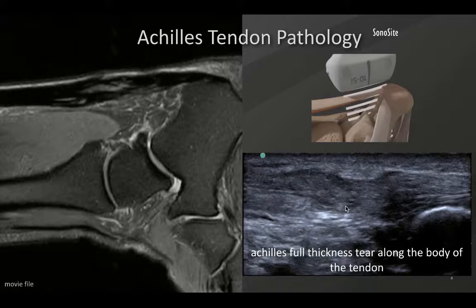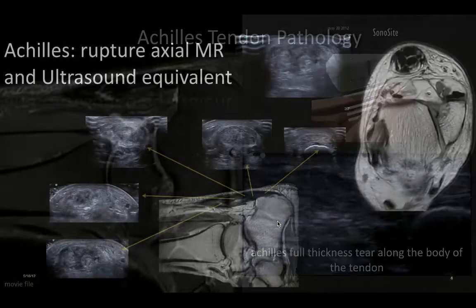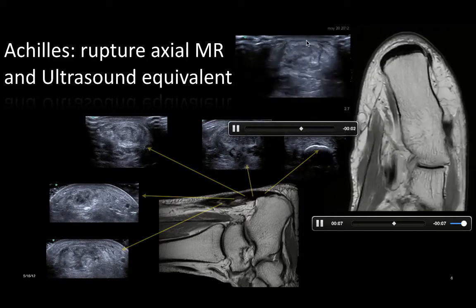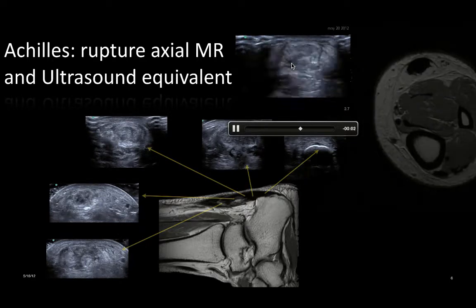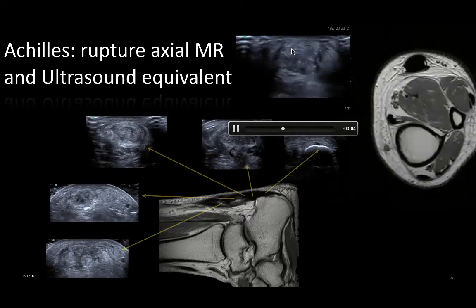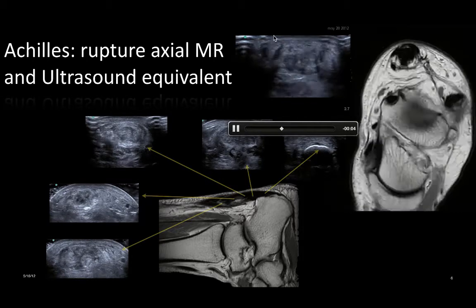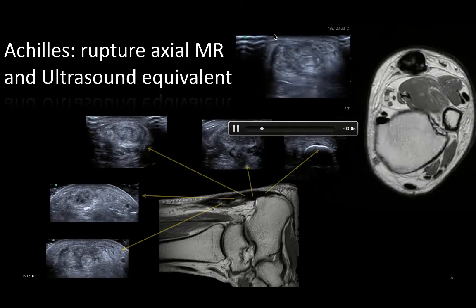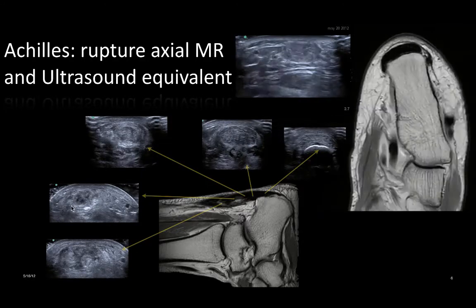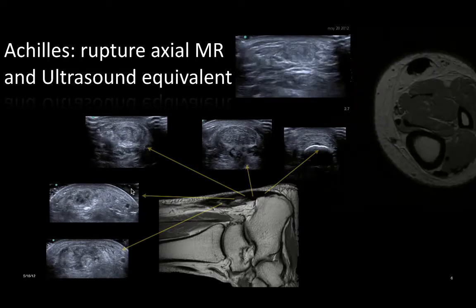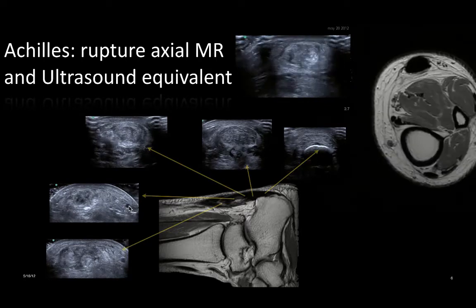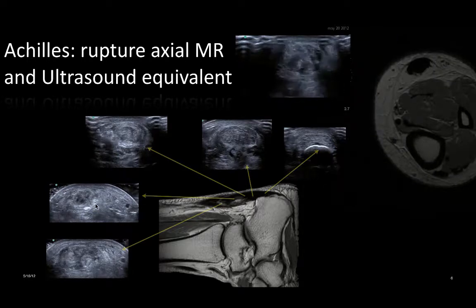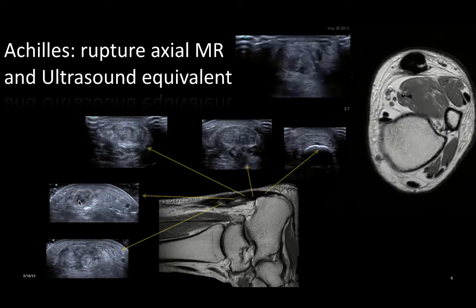The overall architecture is severely displaced. As we look at this tear further on transverse scanning, we're going to take a sweep through the Achilles tendon to its enthesis. One word of caution here is to use lots of gel — you do not want to use a sparing amount, because the pressure of just trying to maintain transducer contact will collapse useful pathology. You'll notice in a lot of these slides that we've built up extra gel on the corners of the screen, and you can see even the superficial sural vein is not collapsed — that's another example of an image that is not over-compressed, so we're not going to lose pathological detail.